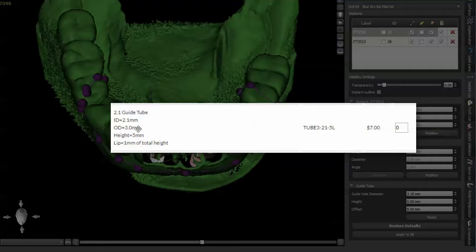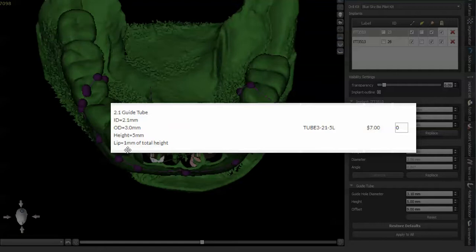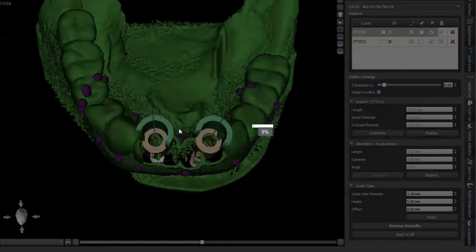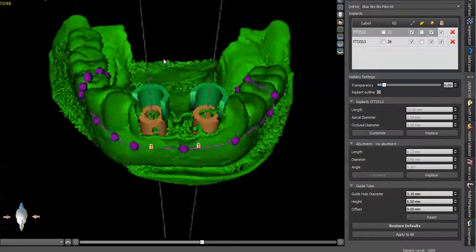So the outer diameter of this one is 3.0, right? So that would fit right into the guide sleeve guide. And the inner diameter is 2.1, and so your drill is 2.0. So this is the part that you would want to order for this Blue Sky Bio pilot drill kit.